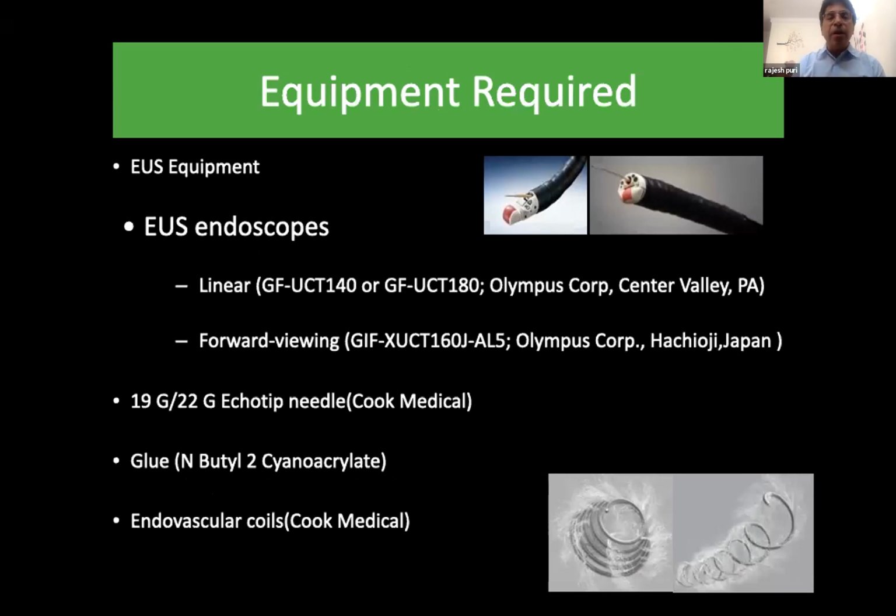What equipment is required? I think the majority of us are using the therapeutic linear echoendoscope, but the forward-viewing echoendoscope is also useful, especially in the fundus.